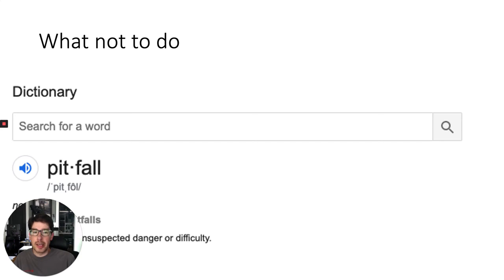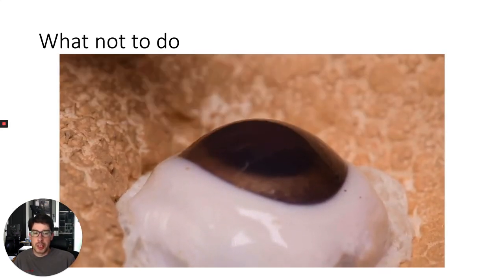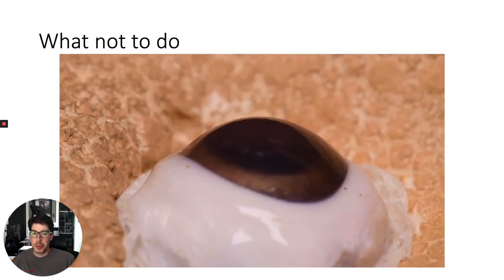Using a pig eye, I'll highlight a couple pitfalls. Do not apply more pressure than is needed to hear the click. Doing so will deform the cornea, prevent successful measurement, and potentially cause corneal injury.